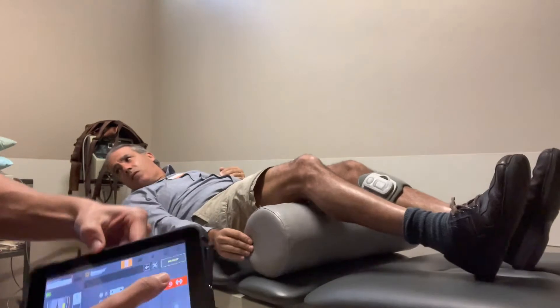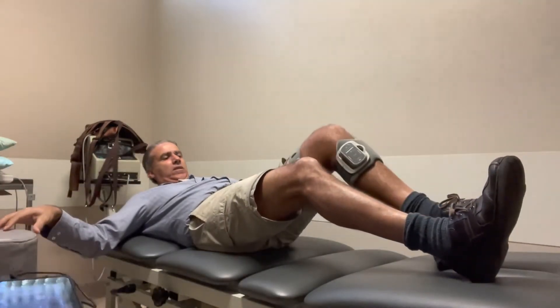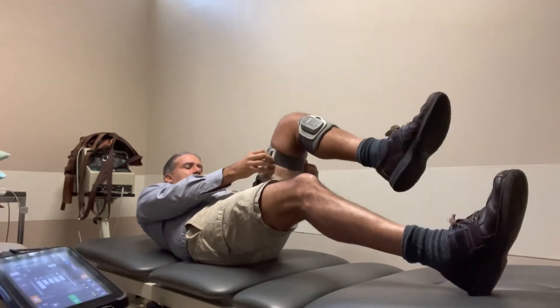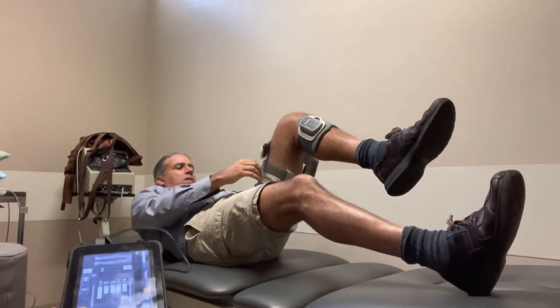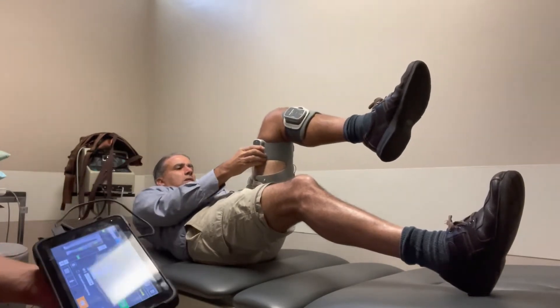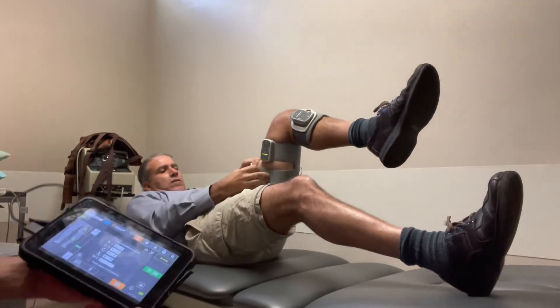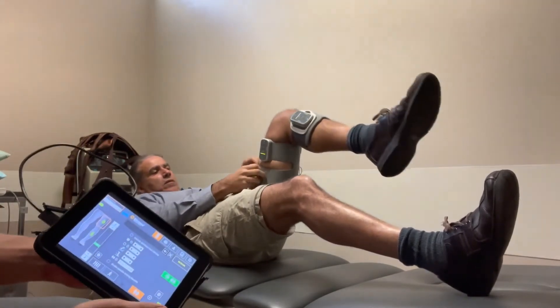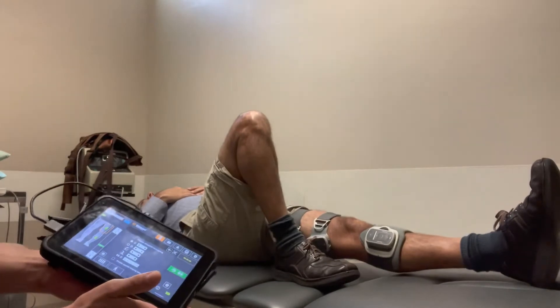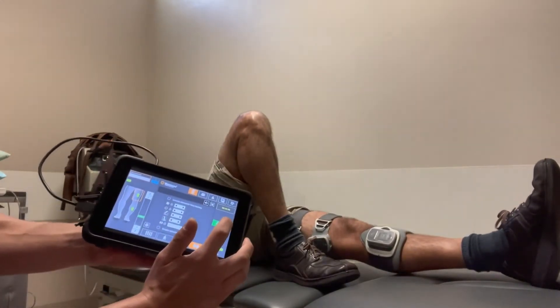Now we're going to pause and flip the cuff around to hamstring orientation. Some similar ideas apply — we're going to go to hamstring sets next. Ideally you'd have the patient set up first to see what intensity they need at the hamstring before you flip it around, so you can memorize that number and then return to training mode.